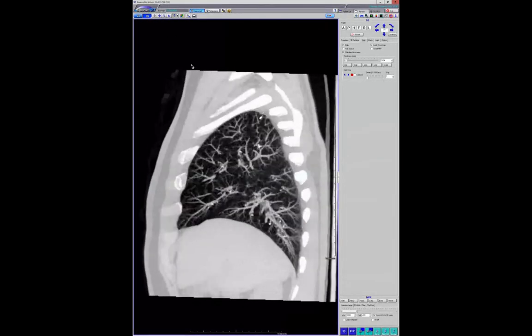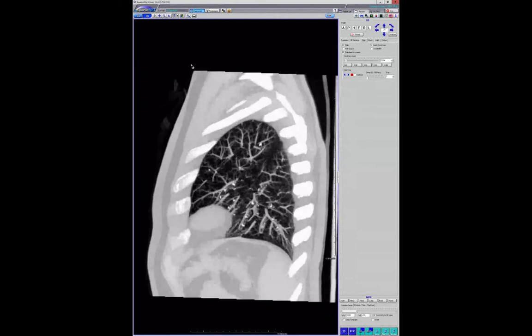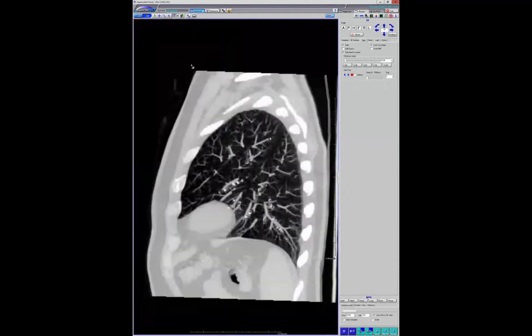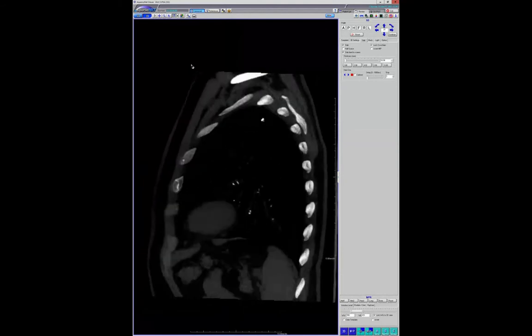I know Travis said he wondered if it was metaplastic bone formation or cartilage formation. I can't remember which one you suggested. It's just really dense. I was wondering if it's all bone. Yeah, I don't know. I have no clue. Anyways, compared to the adjacent cartilage in the trachea, it's so much more dense.